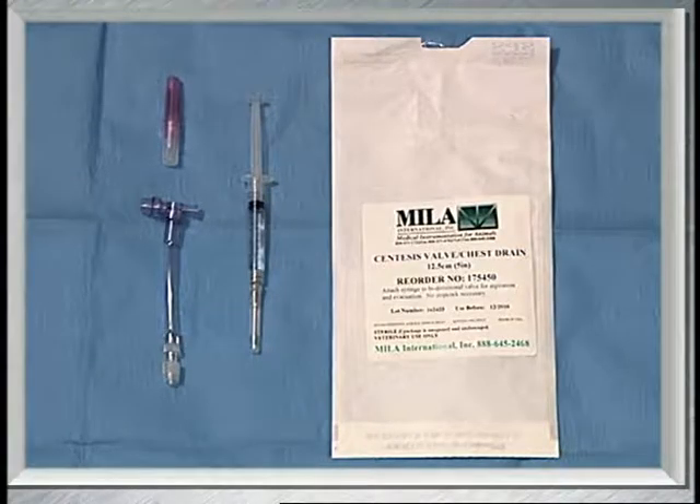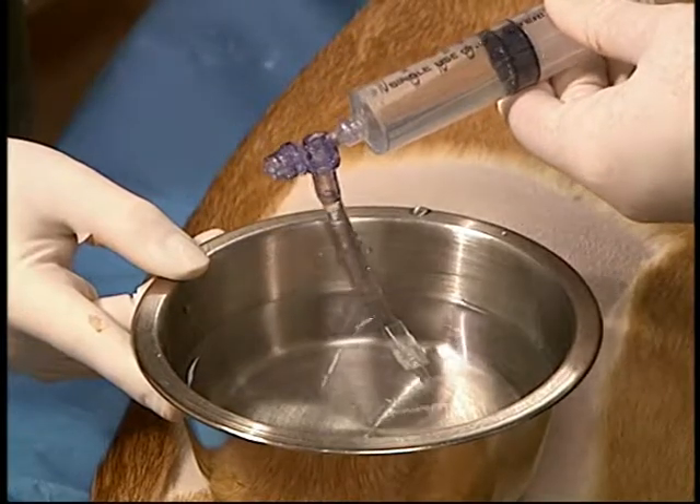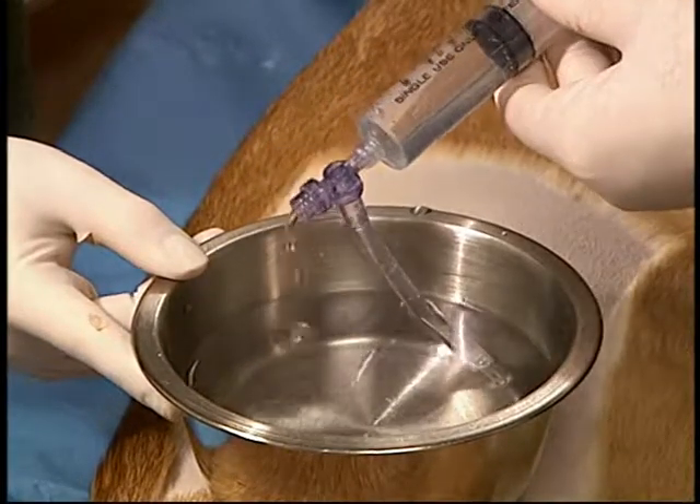The following equipment is required. The Centesis valve chest drain adapter is a very useful device that replaces a three-way stopcock.